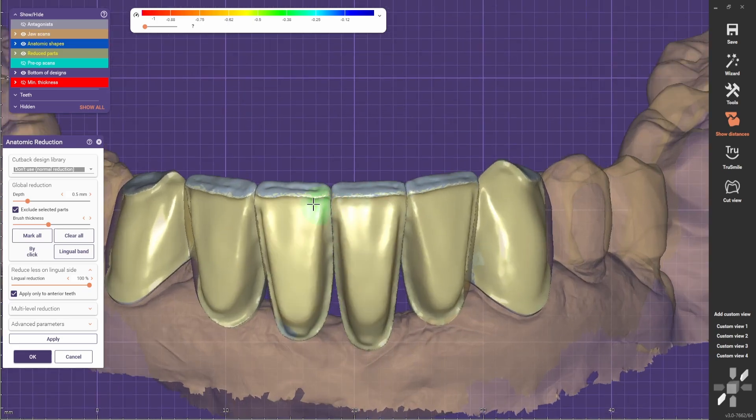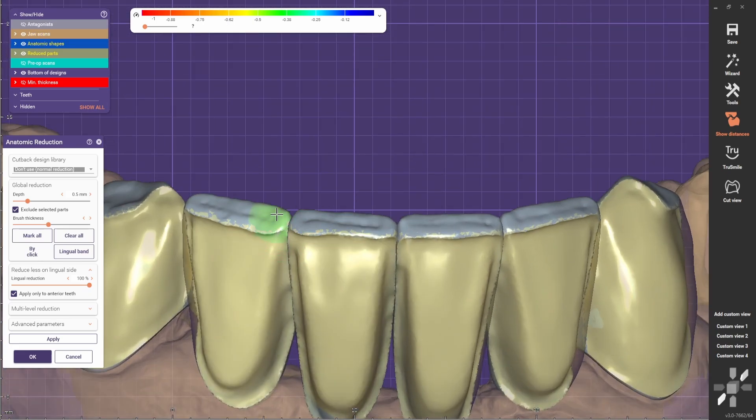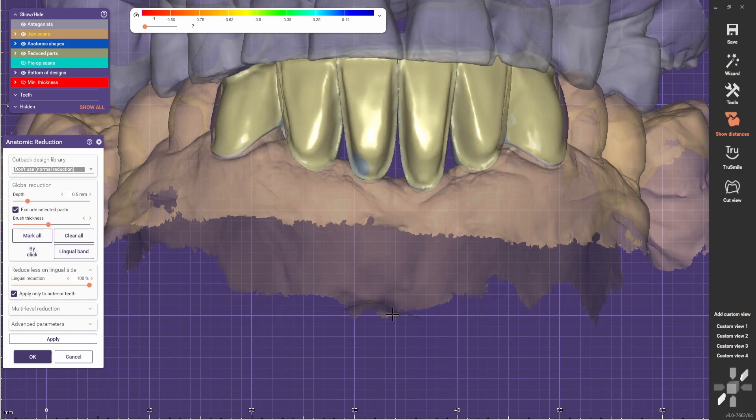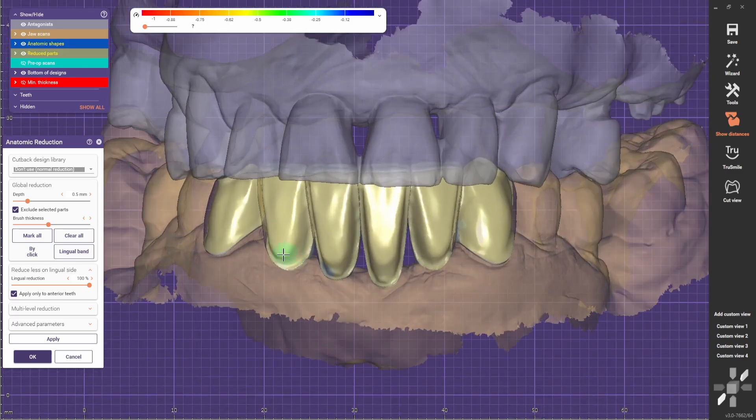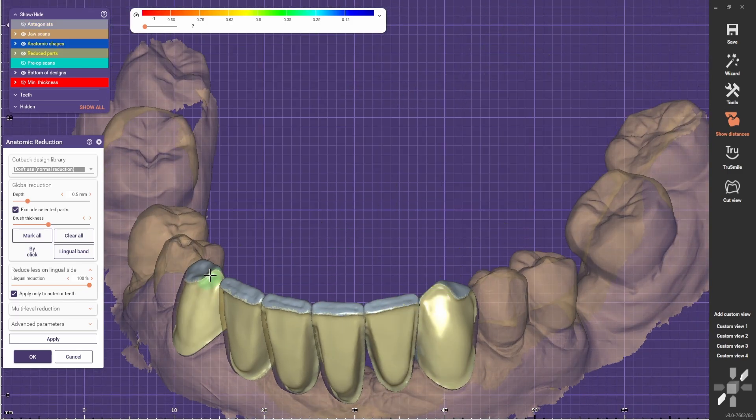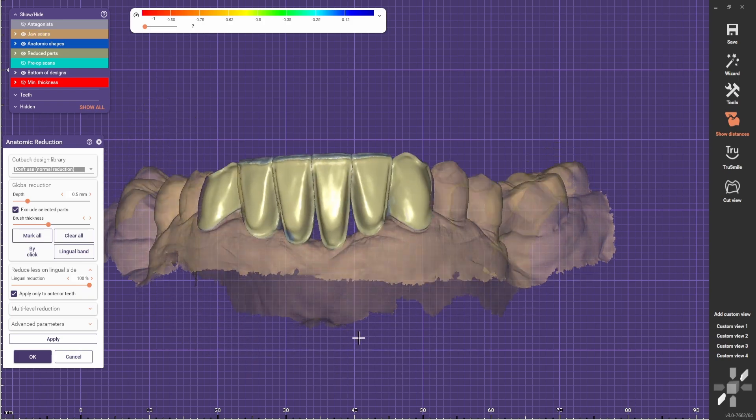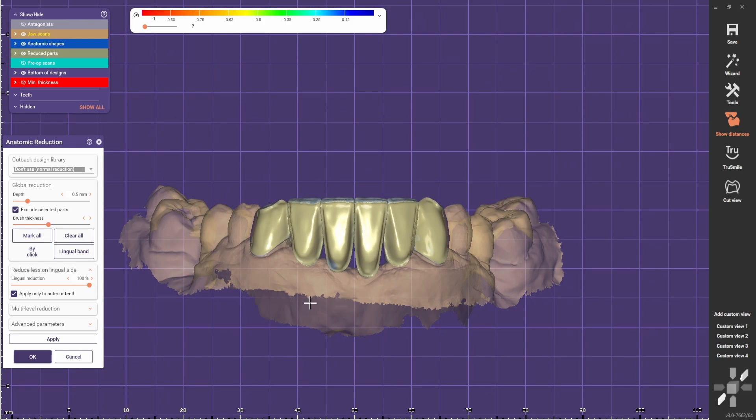If this wasn't such a heavy bite, I would cut back the incisal edges. But for this case, I would leave the incisal edges and the contact points in full contour. This provides extra protection for the layers of porcelain, otherwise it's going to chip off.